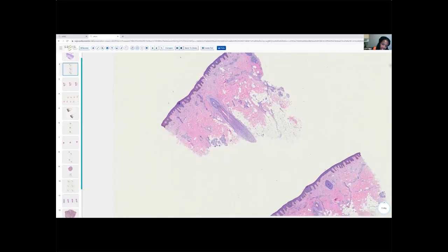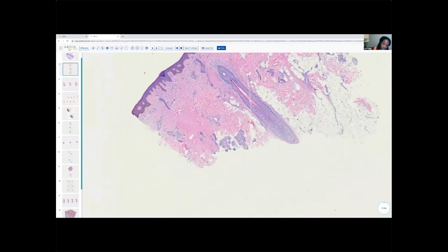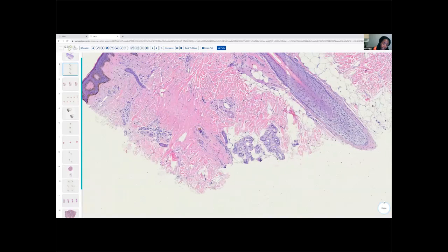Well, look at this. So we have another scenario here where there's clearly an absence of hair. There was a hair there before, but it's gone, it's lost. We have our nice stela there, but look at this. We see this distorted hair follicle, and within it, there's an atypical pigmentation.